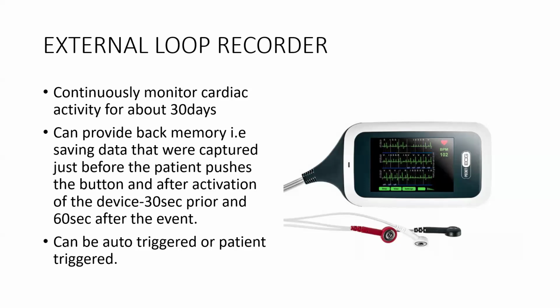So this is able to give an idea of the onset of the arrhythmia and then some few seconds later. It can be both automatically triggered or patient triggered.